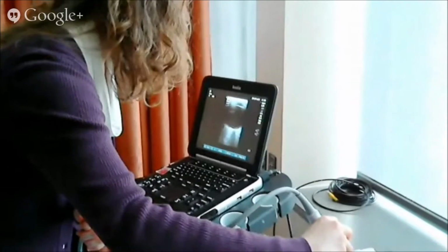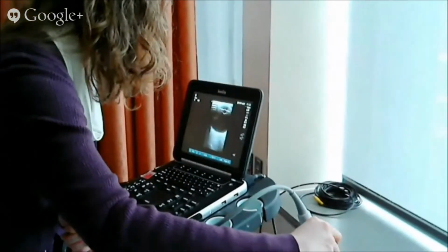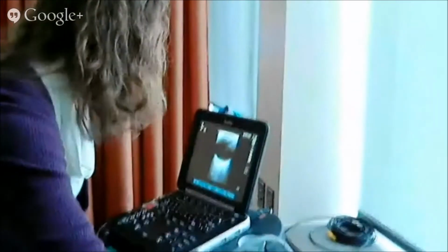And then the optic nerve is 4.3, the standard depth. It's usually a little bit more shallow than that, but I just want to make sure we have everything in the image so we can kind of see it.